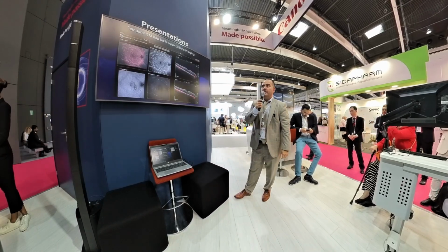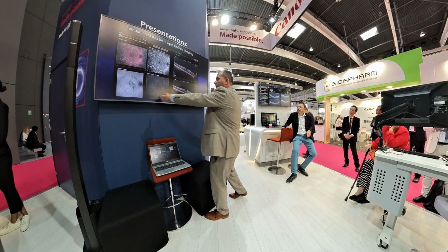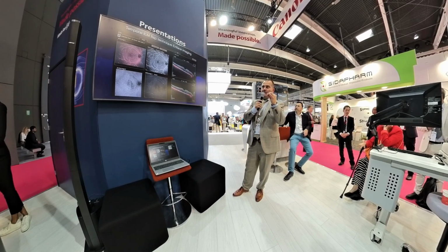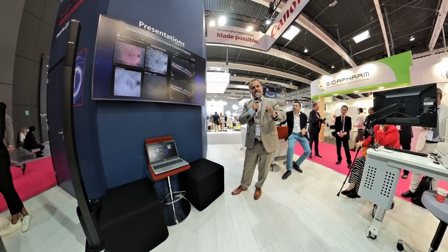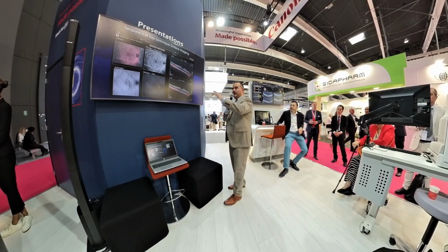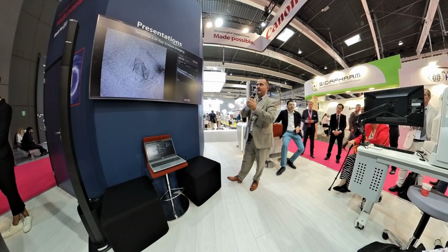This is a coronal scan or en-face scan plus OCTA of a technique called temporal ILM flap for closing the macular hole. So we can really appreciate with a high level of resolution and detail how our flap sits after the surgery, not how we place it during the surgery, but what is the evolution of the flap and the anatomy of the macula. A larger image of this en-face scan.